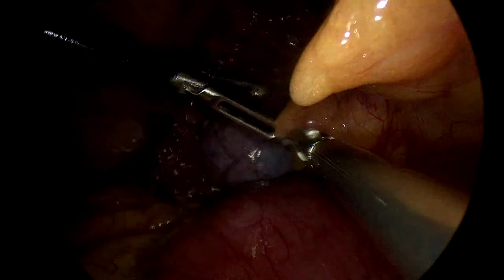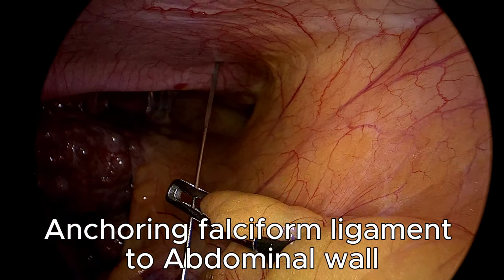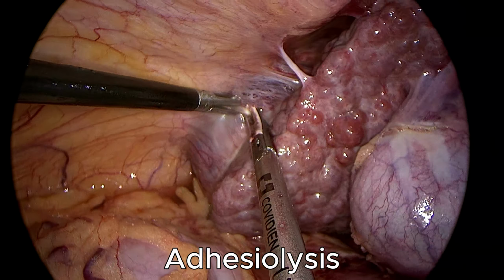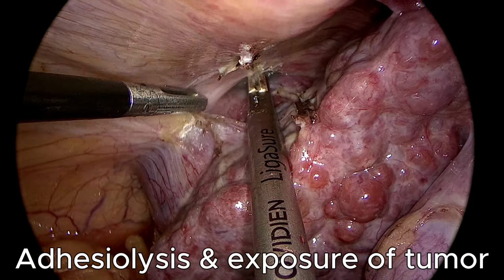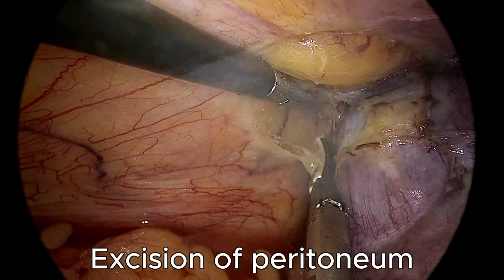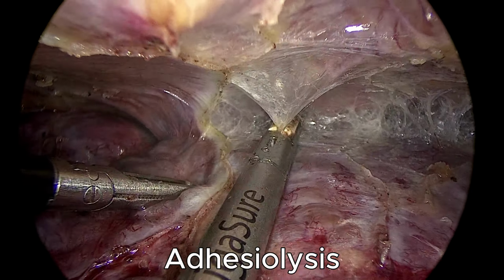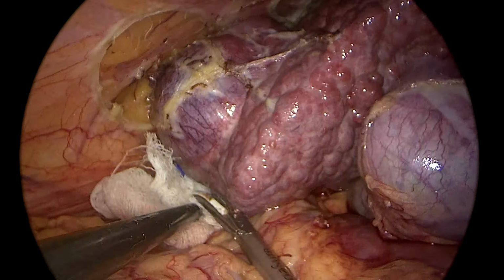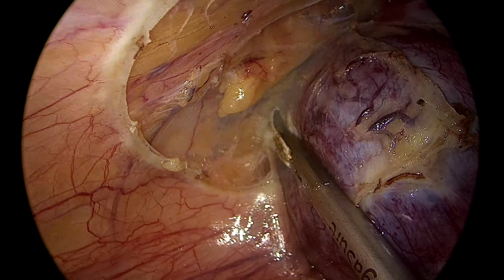Now, beginning the procedure. The first step involves anchoring the falciform ligament to the anterior abdominal wall using sutures. Next, we perform adhesiolysis between the liver and the abdominal wall to mobilize the right side of the liver. Careful dissection helps in safely exposing the tumor located in segment 6. This is an exophytic tumor located peripherally, making it amenable to minimally invasive resection. We are taking peritoneum along with our dissection to achieve a tumor-free margin.